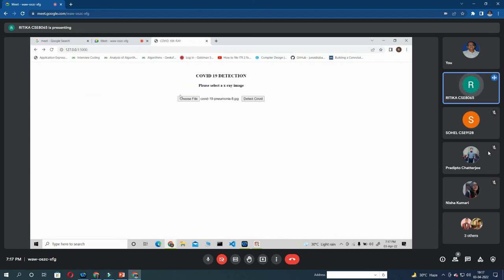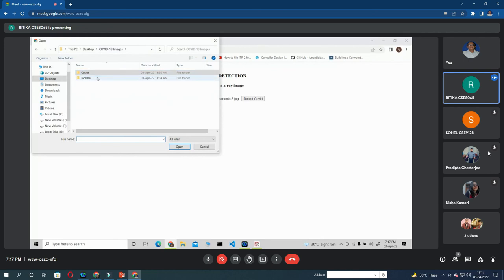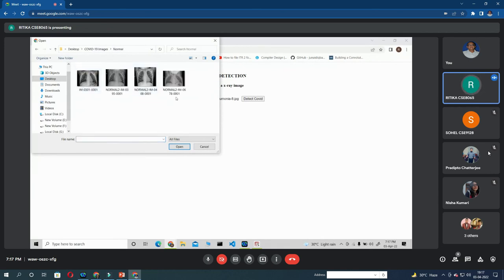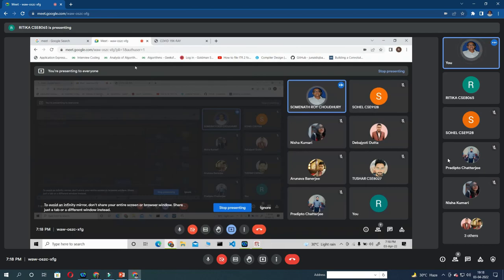Now suppose I am choosing an image from normal folder. So here suppose I am choosing this image. Detect COVID. And it is showing.